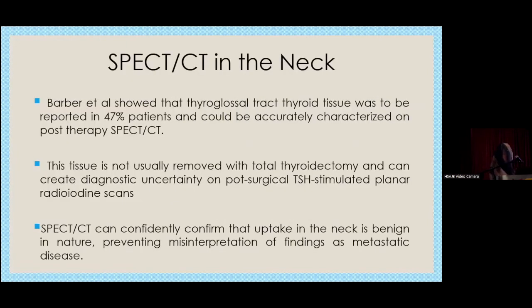All right, Barber et al. has shown that thyroglossal tract thyroid tissue was reported in 47% of patients, and it could be accurately characterized on post-therapy SPECT-CT. And the tissue is not usually removed during total thyroidectomy, and it can create a diagnostic uncertainty on post-surgical TSH-stimulated planar radioiodine scans. SPECT-CT can confidently confirm that uptake in the neck is benign in nature, preventing misinterpretation of findings as metastatic disease.